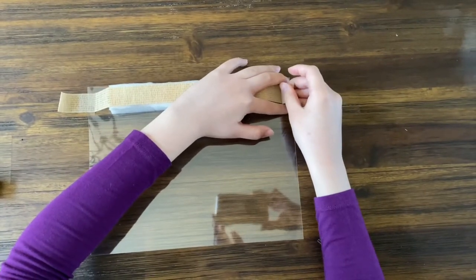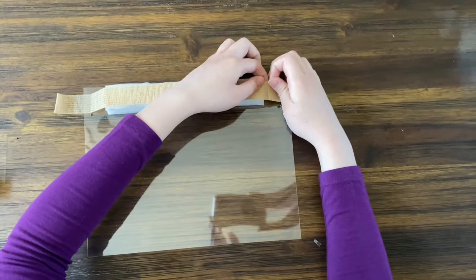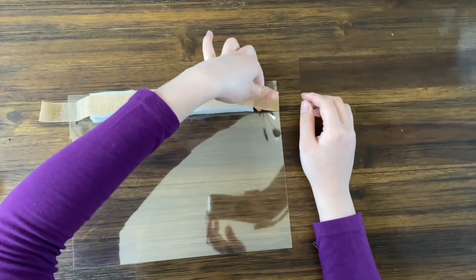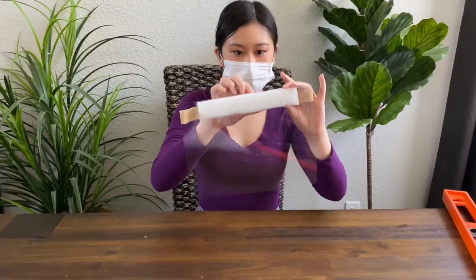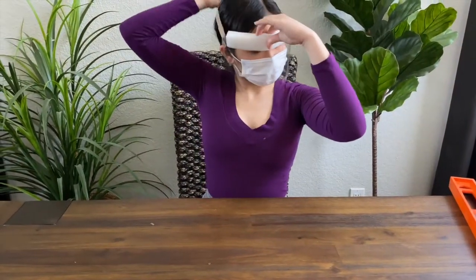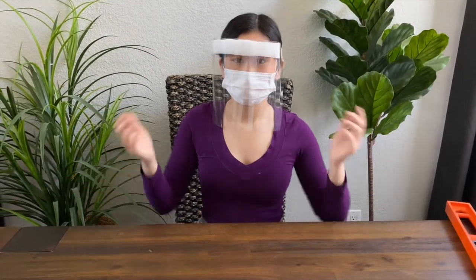You're going to fold it over and then press the top part of it so that it doesn't come off. And then just like that, you have a working face shield. So how this works is you pull it like this, and then you put it over your head, and then you have a working face shield.